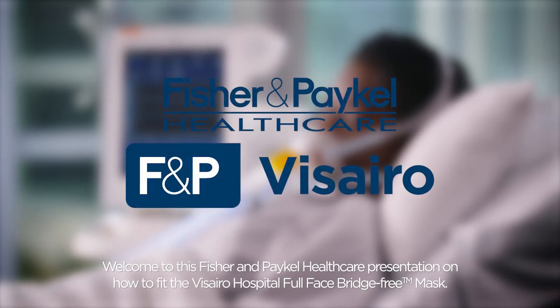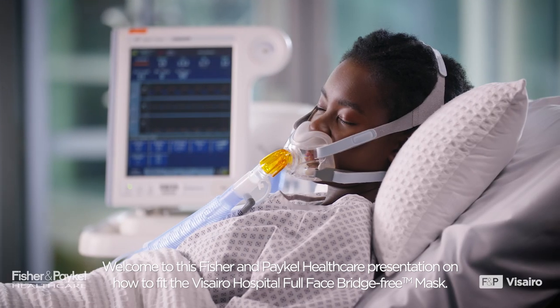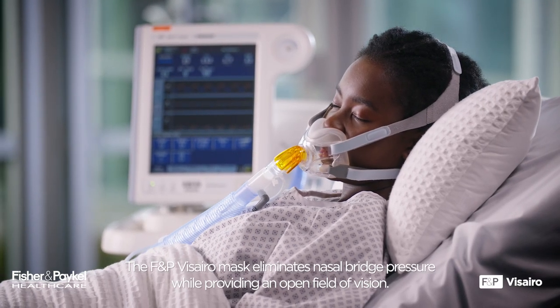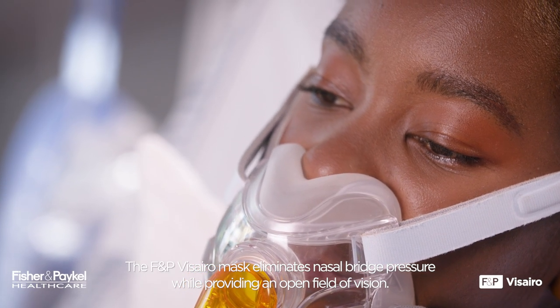Welcome to this Fisher & Paykel Healthcare presentation on how to fit the Visairo Hospital Full Face Bridge-Free Mask. The F&P Visairo Mask eliminates nasal bridge pressure while providing an open field of vision.